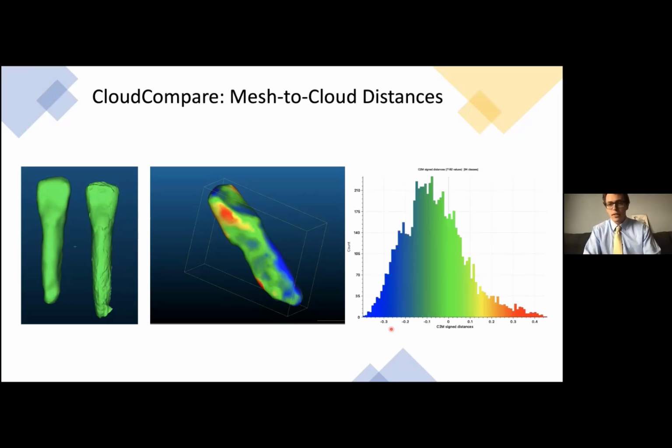But not all of the teeth fell within that half millimeter 100% of the time. And so after we had collected every single sample from both cone beam and medical grade CT and run this comparison, we had the histographical representation of how much of the tooth fell within half a millimeter.